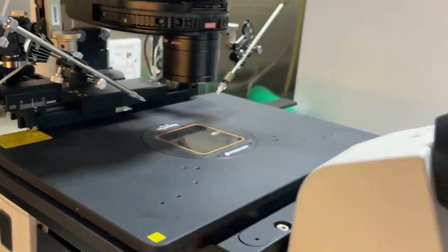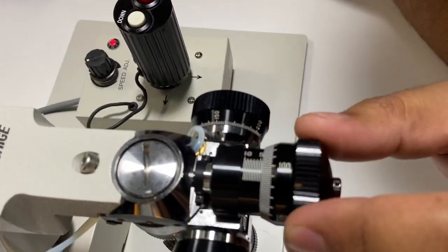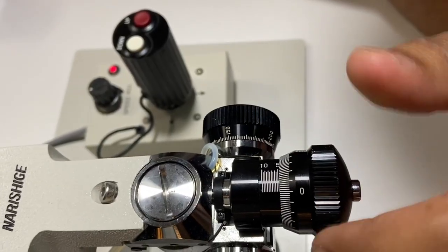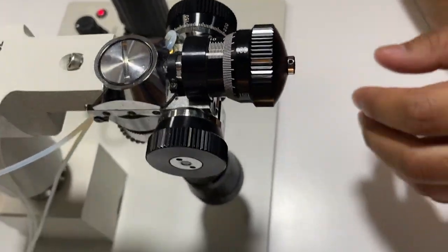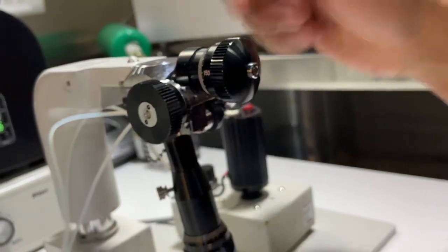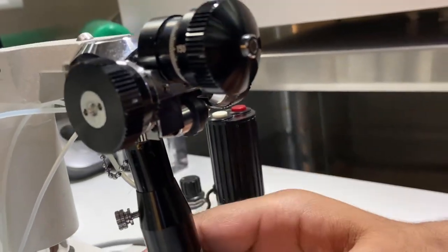At the same time, we have to check in our handle that everything is aligned in the middle. If you see here, there is 10, there is 5, and then 0. We always need to keep it around 5, so we are doing it right now. That is the middle, the 0 of our machine. Similarly, from downstairs, you have 0, 5, 10. This also needs to be always at 5. I'm moving it, and now it is almost on the 5, so that means it is on the 0.